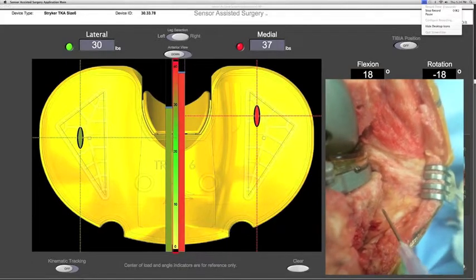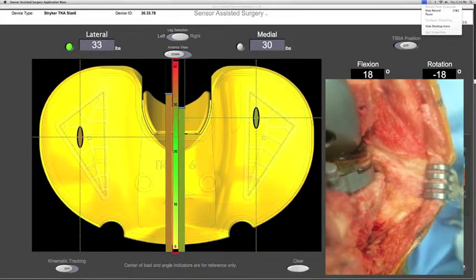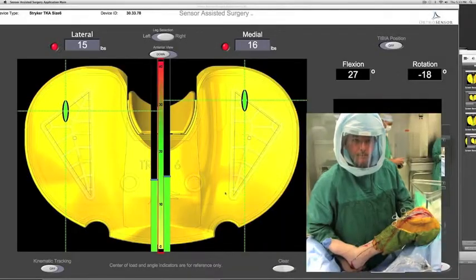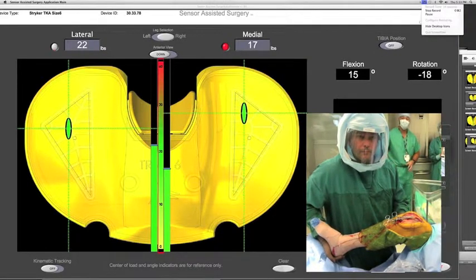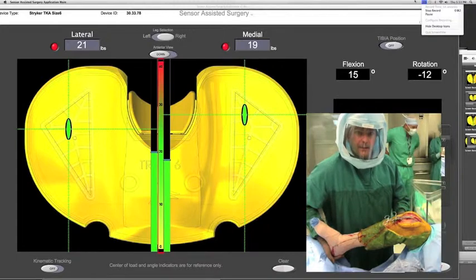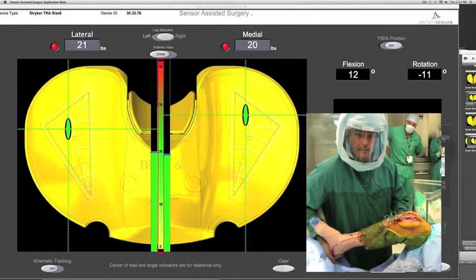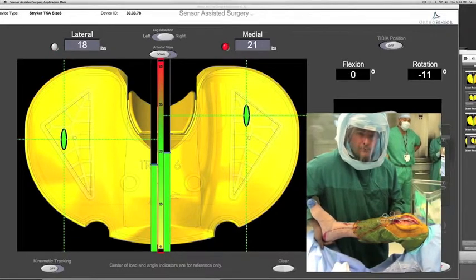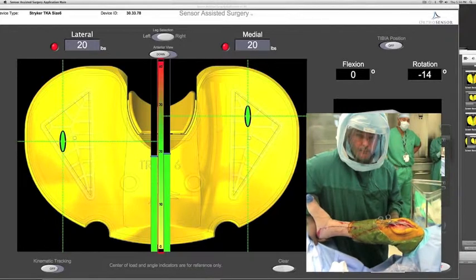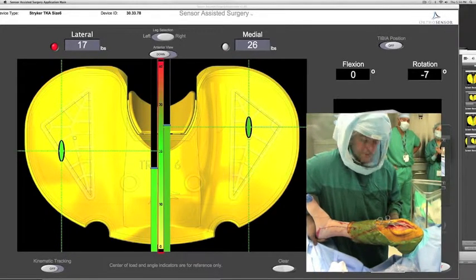The graphic user interface is showing that the medial loads are sequentially coming down as more of the load is being shared in the lateral compartment. This is done until the intercompartmental balance has been optimized, and this is confirmed by distracting the knee joint in multiple planes. The surgeon takes the knee from flexion into extension, and you can see now where we have appropriate soft tissue balance. The loads are within several pounds of each other, and this is seen through a full range of motion.